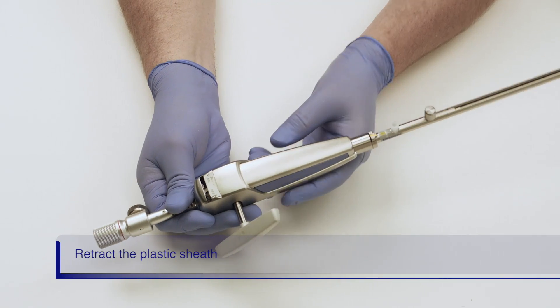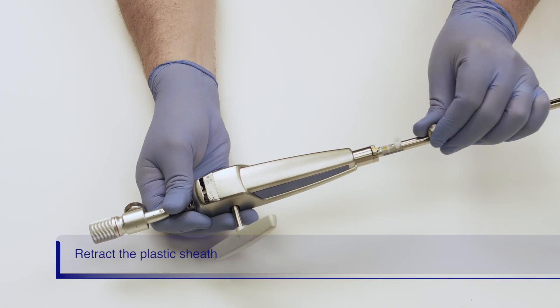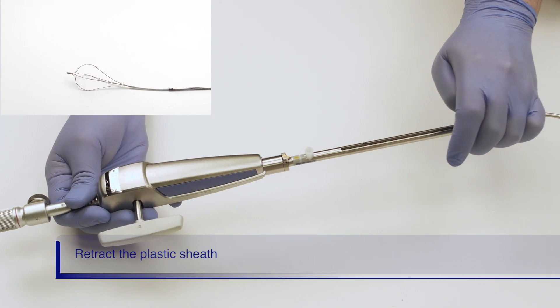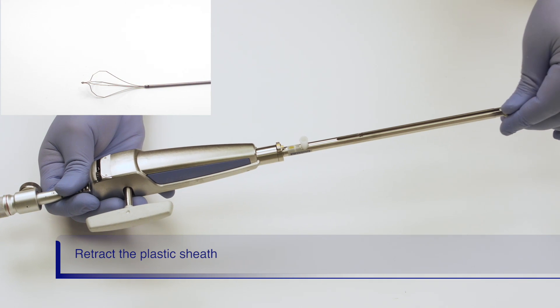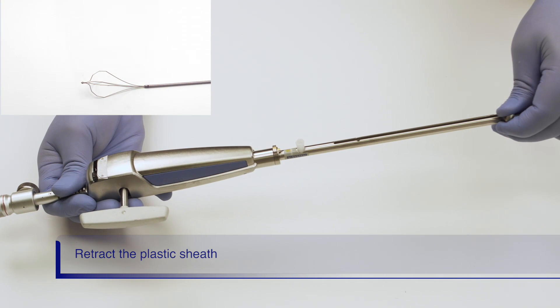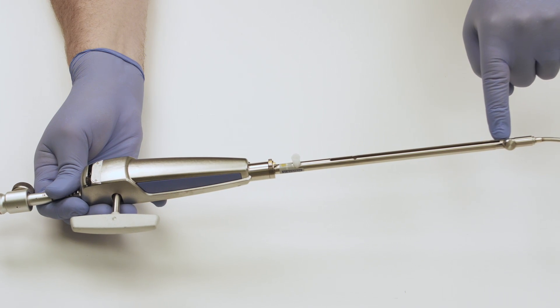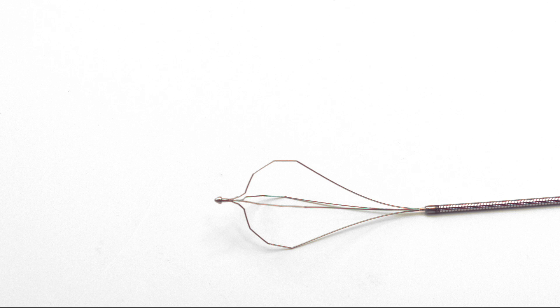The plastic sheath is retracted by loosening the knob on the basket sheath by a quarter turn counterclockwise. Advance the knob forward and into the locking groove, then tighten the knob by turning it clockwise. As you can see, the plastic sheath is fully retracted and we will have metal on metal contact with the stone.